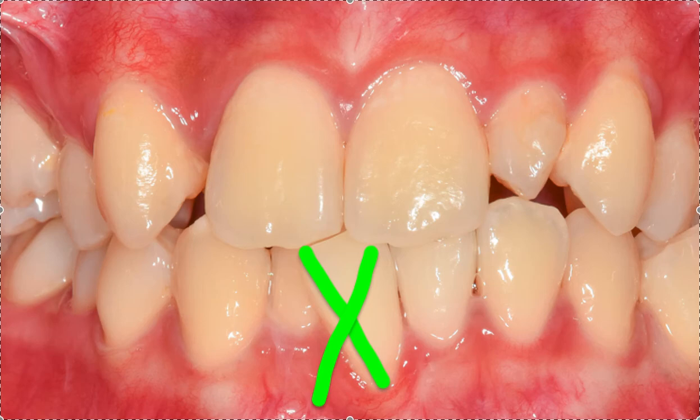So that's how I handle it within Invisalign. Now, if you're using a different system, they may not allow that. Invisalign is very flexible on passive aligners, especially at the beginning of treatment, especially if you explain the why behind it, because it is very traumatic for patients to go home without a front tooth. That way they're going home and they've got something to wear over it.